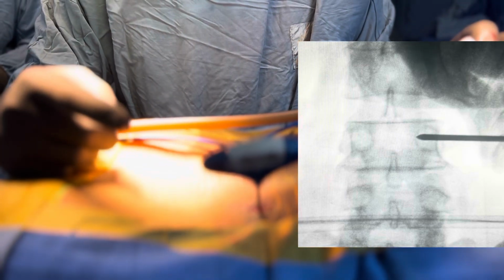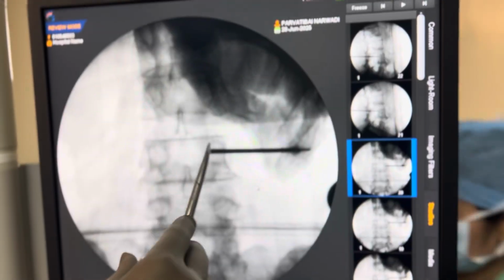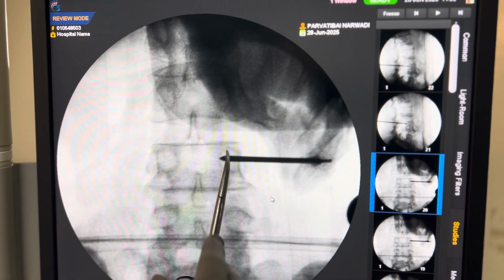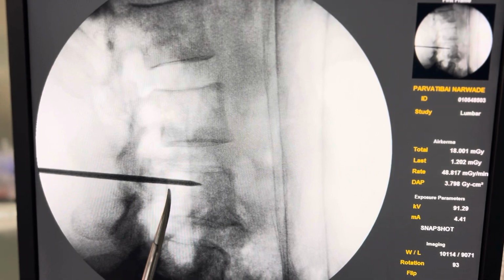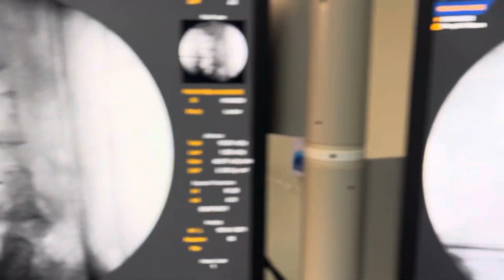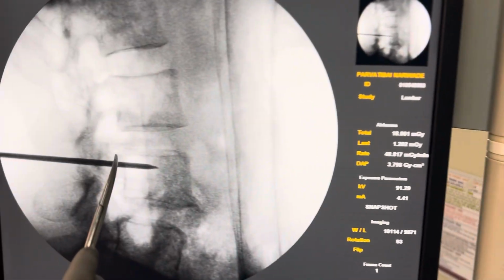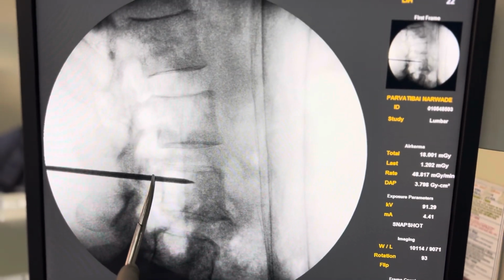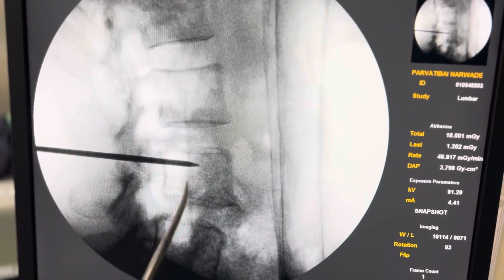Now I am going to take a lateral view to confirm whether I am in the pedicle or in the body. In AP view, my needle is already touching the medial border of the pedicle, and in lateral view I have already crossed the pedicle and I am in the body, so I am safe. If my needle is touching the medial border of the pedicle and in lateral view I am still in the pedicle, that means I am going to break the medial wall of the pedicle. In that case, we have to decrease the medial angulation and relocate the needle.